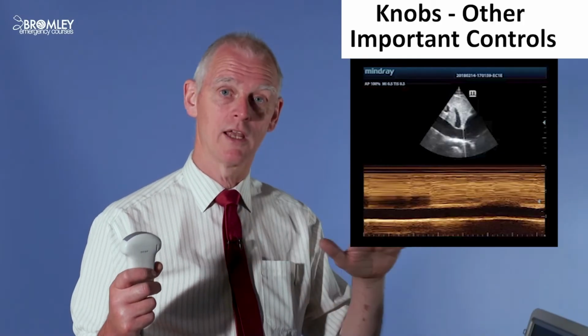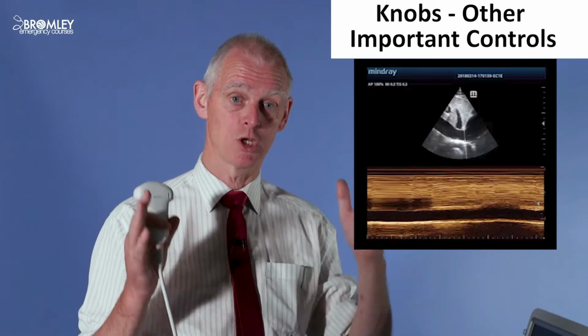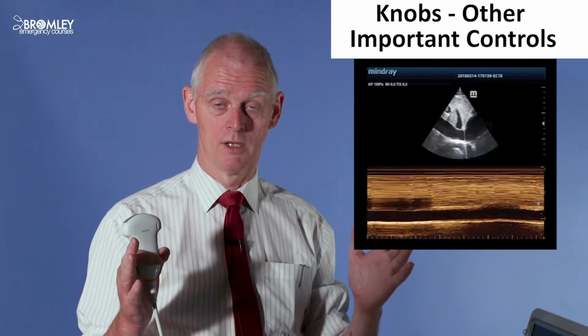Across the width, it's produced by which crystal. The depth, of course, the probe's at the top. The depth down of each individual bright spot is determined by the delay, how long the signal took to come back. And then the strength of each bright spot is determined by, again, the intensity of the image coming back. So all that information is put together to produce a two-dimensional image.